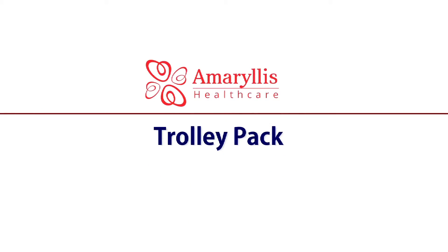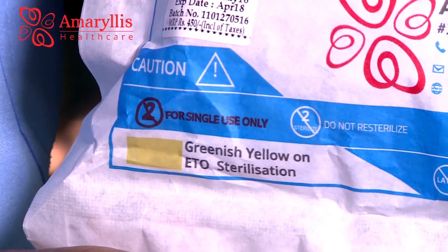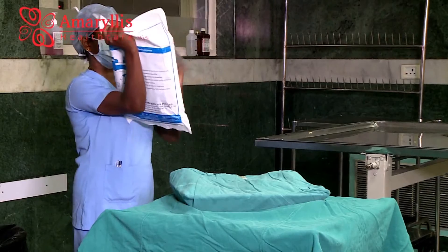Trolley draping technique. The pack is sterilized as per the standard protocol. The trolley draping is to eliminate the passage of microorganisms between non-sterile and sterile areas.